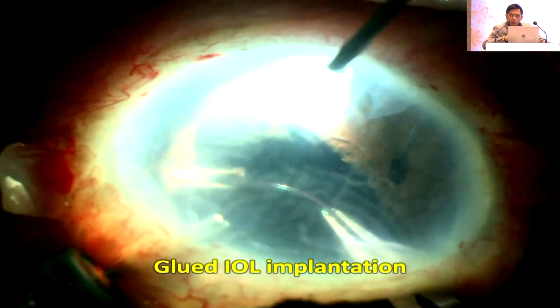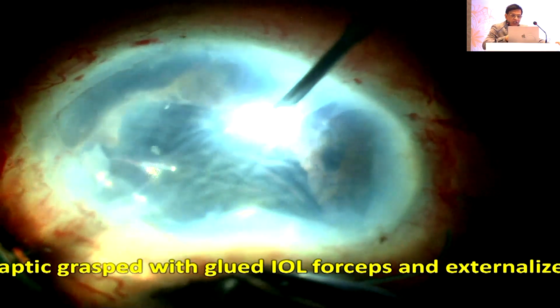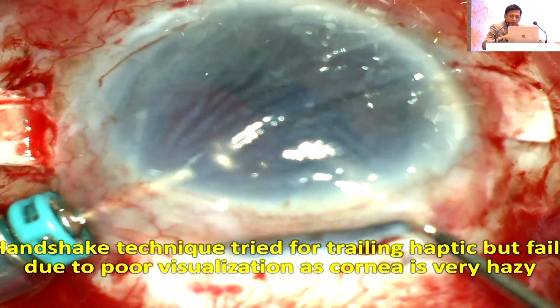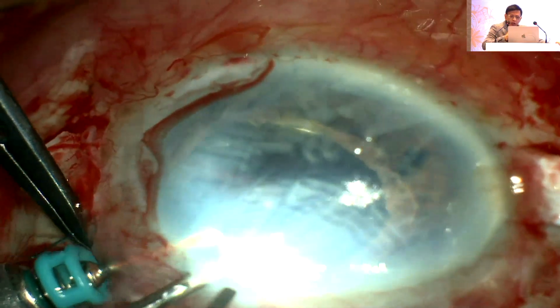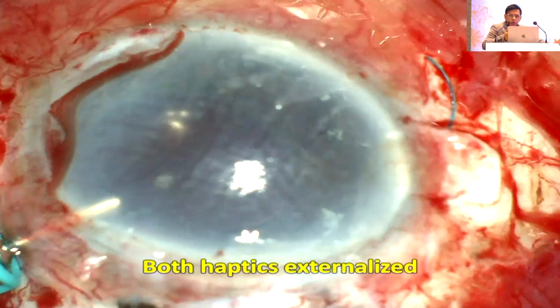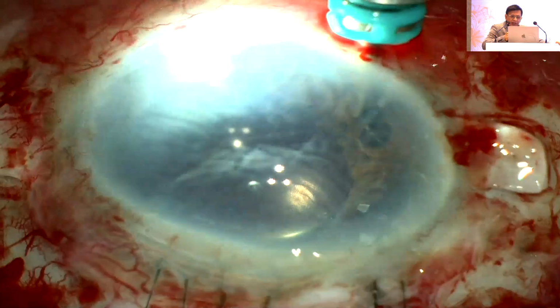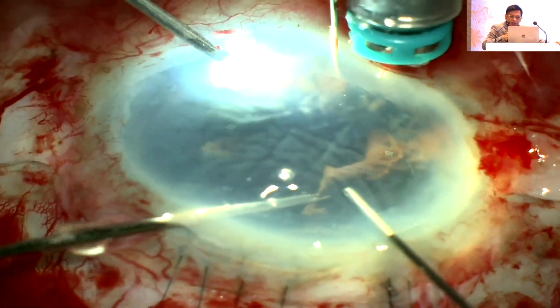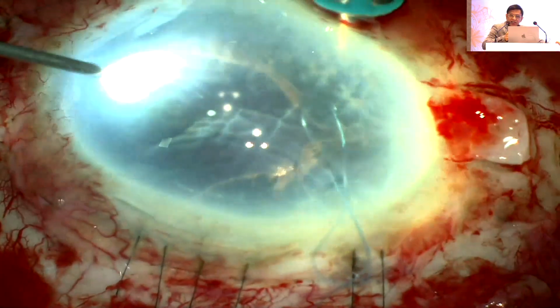that IOL. Once that's out, I now go in with the glued IOL technique, and you can see me doing that just now. Once that is done, my next step is, obviously, I need to make that pupil small. So I'm going to do the pupiloplasty. I already have a large incision, so I just implant it like a non-foldable IOL, tuck the haptics inside. Once that's done, now I start my pupiloplasty. But look how friable that iris is. Wherever I touch, it starts tearing.